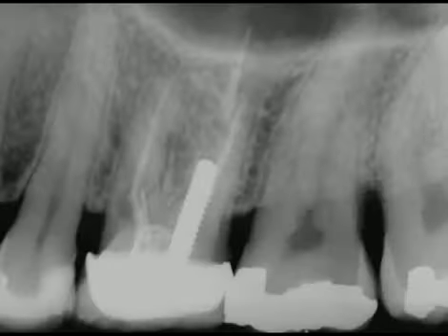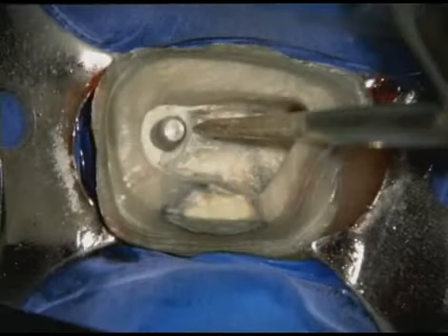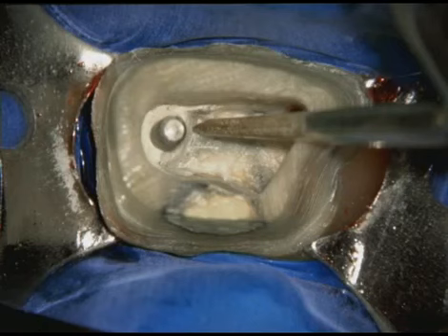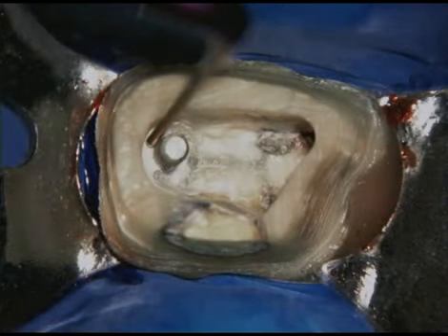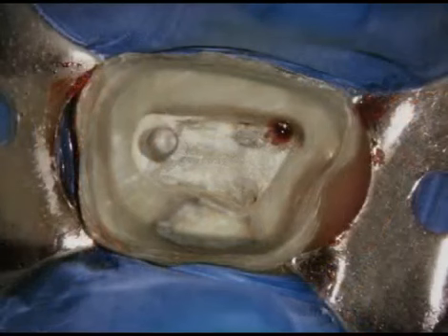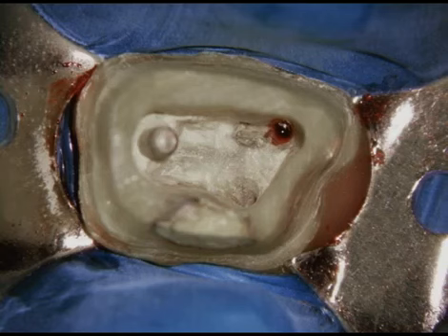This radiograph shows incomplete endodontics and resultant failure. Note the poor fitting crown, internal resorption, furcal involvement, and the large post. Circumferential material can be progressively sanded away utilizing appropriately sized Pro Ultra endo tips. A smaller, more parallel instrument may be selected when space is restricted. Here we can visualize straight line access to the fully exposed post, bleeding from the MB1 orifice and evidence of an MB2 orifice system. In this case, I utilized the post removal system.